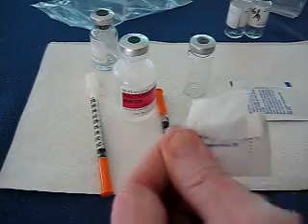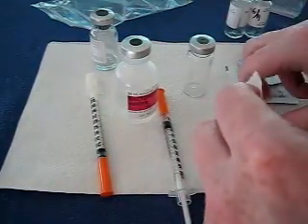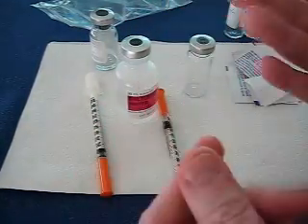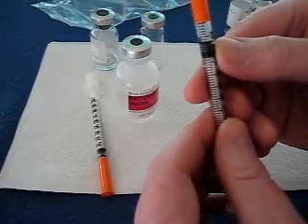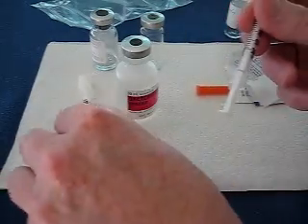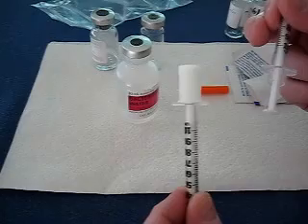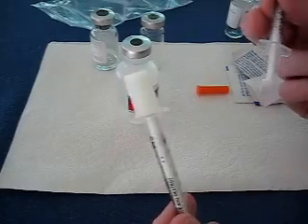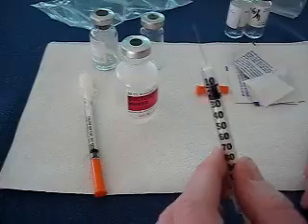You always need to make sure you're working with a sterile situation, so I have an alcohol swab here. I clean the top of the bottle — make sure I clean it well. I've already washed my hands to make sure my hands are clean, because you want to stay clean and sterile. I filled the needle up to the 15 mark with air and take off the cap. When it's a fresh needle, it's got a bottom cap on it also. Once you remove that bottom cap, it means the needle has been used. Never put the bottom cap back on because you can't use these twice.